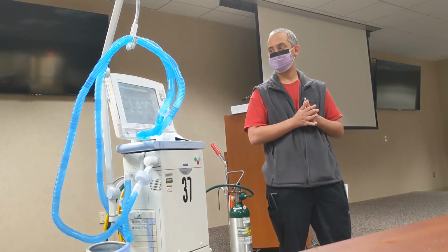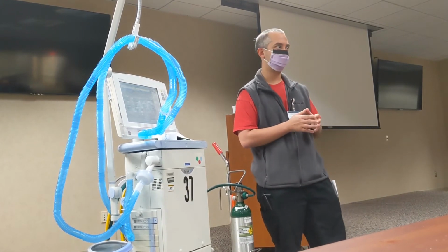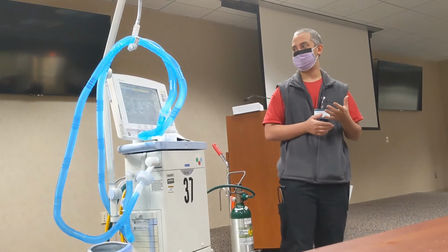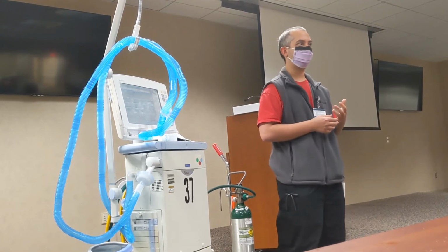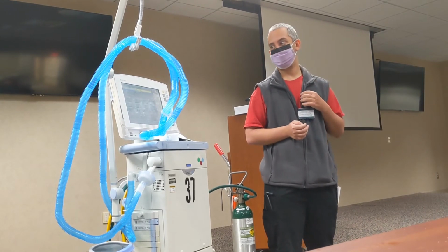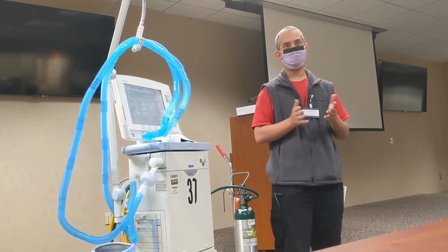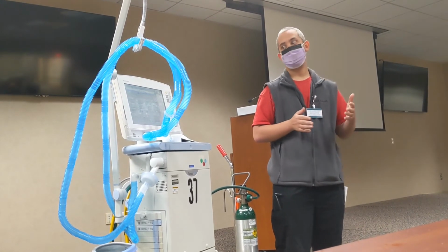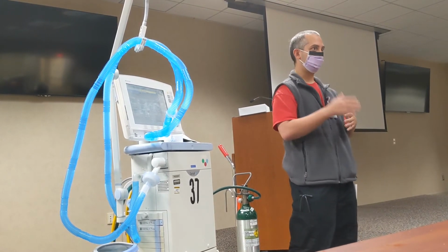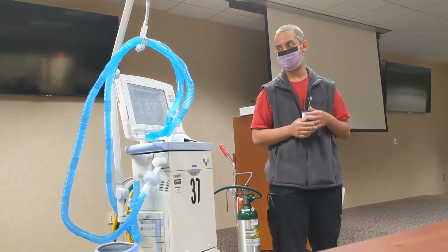And then, one of the big issues that I think has come up has been making adjustments based on our blood gases, and all the physicians are going to be a little bit different, but in general, if you've lost ventilation, you're hypercapnic, that doesn't necessarily mean you need to take them off and put them back in either volume control or PRVC or whatnot.